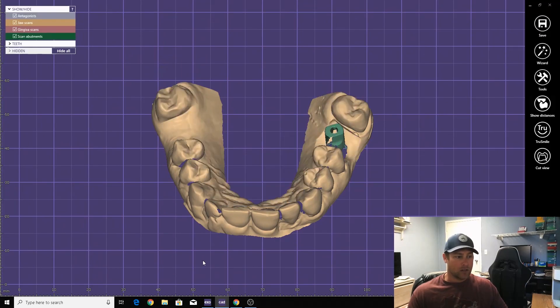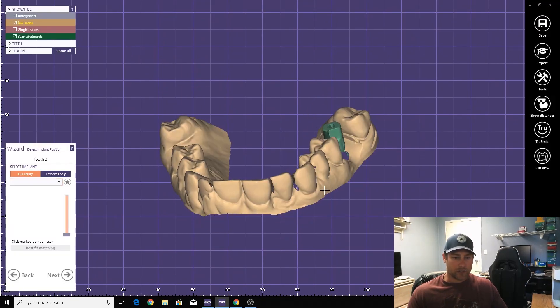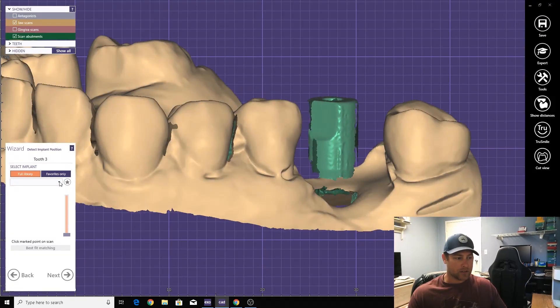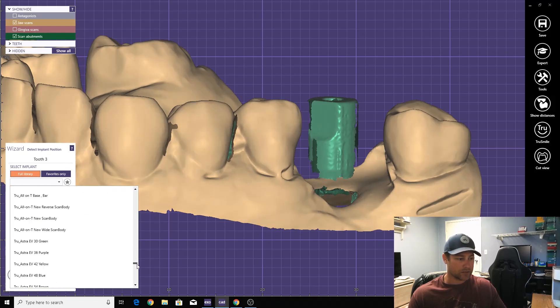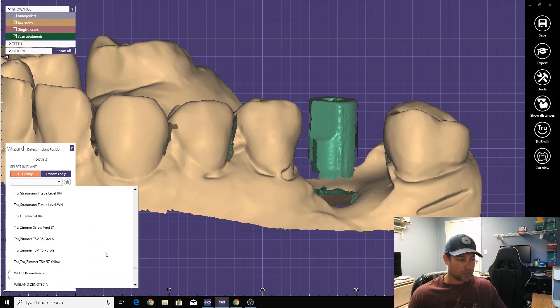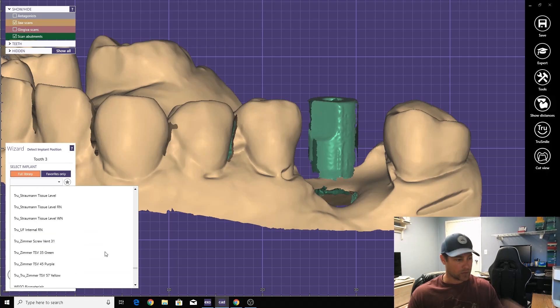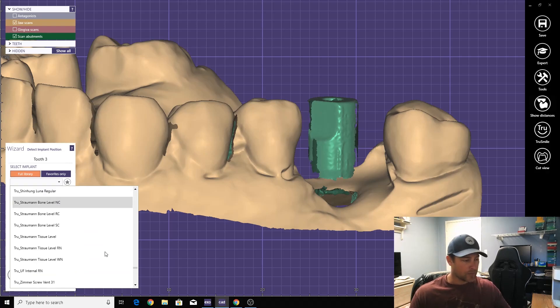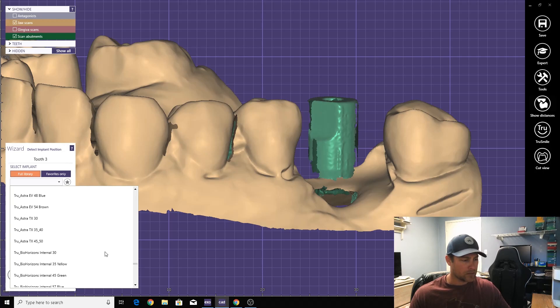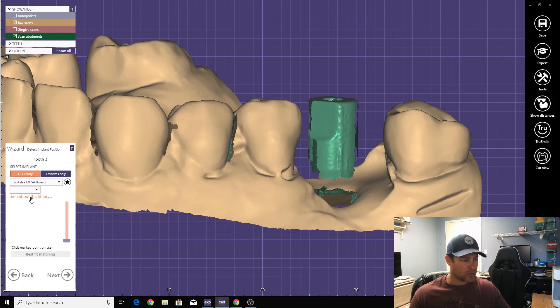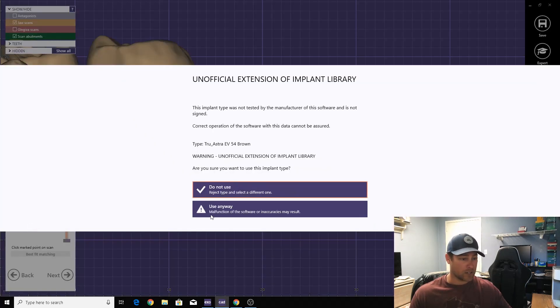Turn this off. All right, first thing is to orientate the scan body. Choose the library. This one is a true abutment, that's what the doctor ordered. Astro EV, 5.4, 5.5 millimeter height for the tie base.